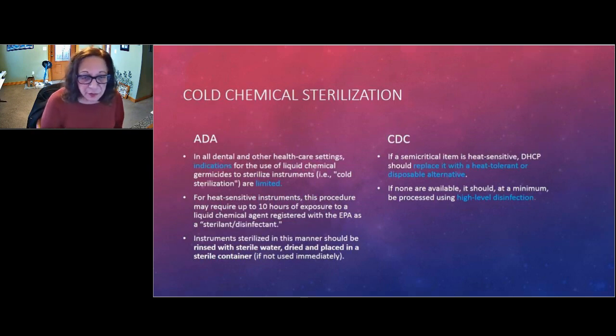Last but not least, I'm going to compare what ADA and CDC both say about cold chemical sterilization. Pretty much the ADA says there's limited need for it in dentistry. But you may have to soak for up to 10 hours to actually achieve cold chemical sterilization. And they do recommend that if you are doing cold chemical sterilization, you rinse with sterile water, dry the item, and put it in a sterile container if you're not going to use it immediately.